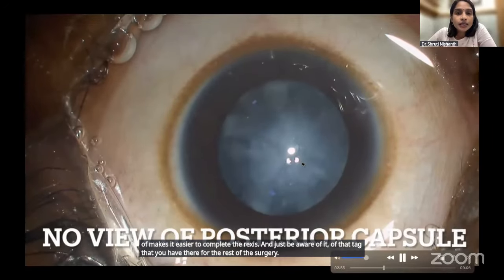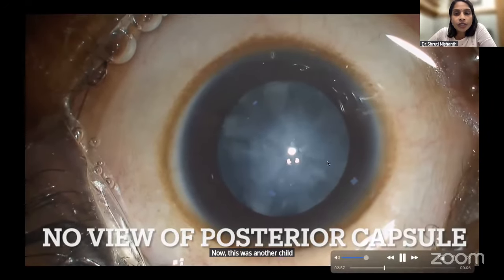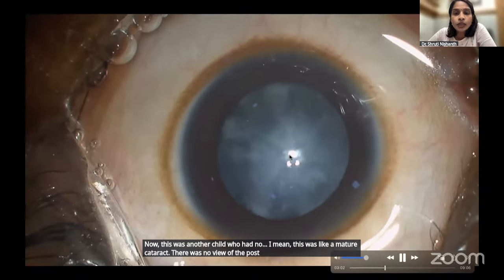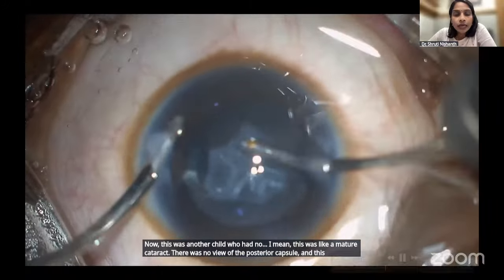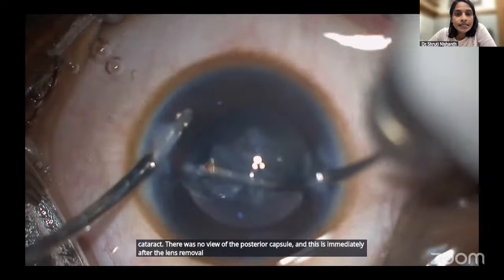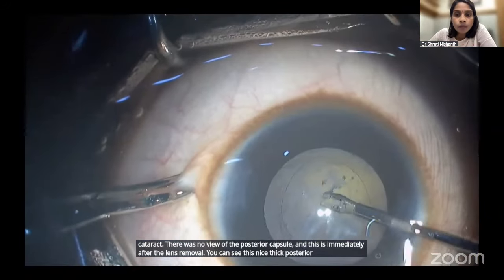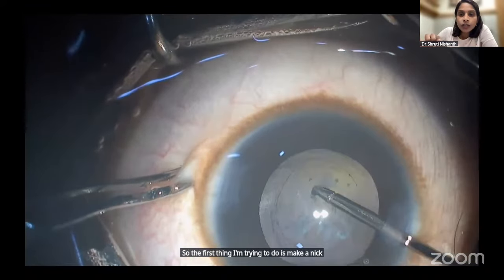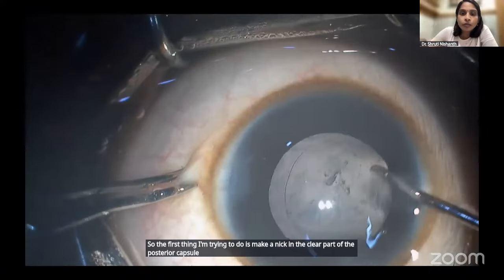Now, this was another child who had a mature cataract. There was no view of the posterior capsule, and this is immediately after the lens removal. You can see this nice thick posterior plaque that we saw. So the first thing I'm trying to do is make a nick in the clear part of the posterior capsule and try to go around it.